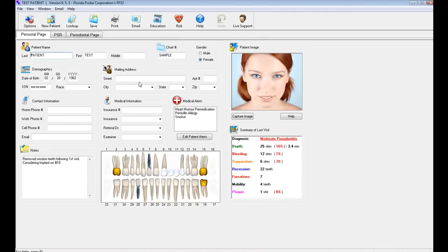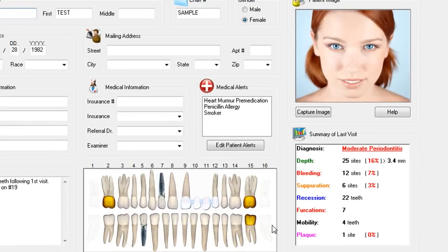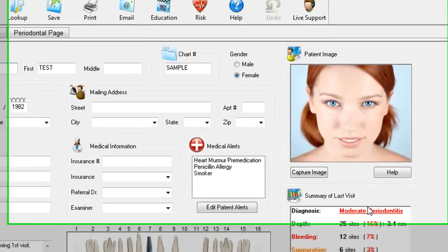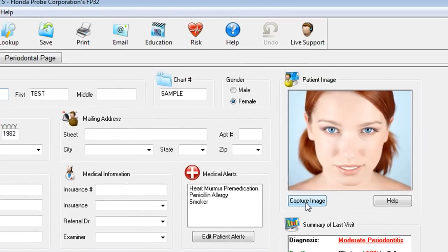You'll notice that we're starting on one of three different tabs. The personal page is where we view the name and chart number, and notes. You have a quick overview of the missing teeth as well as a summary of the last visit. We could also input their image through the web camera attached to this laptop.